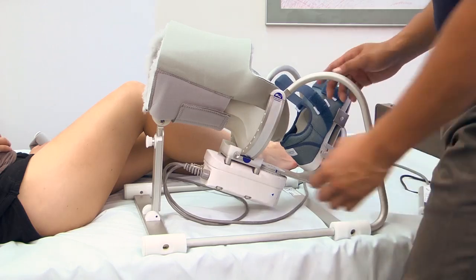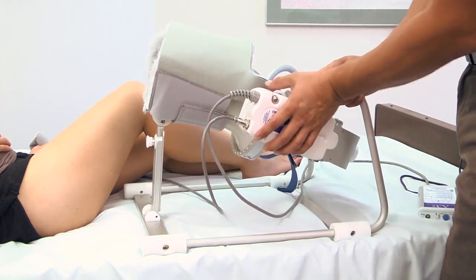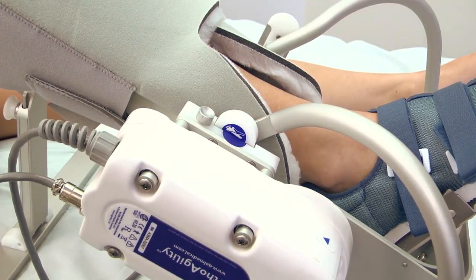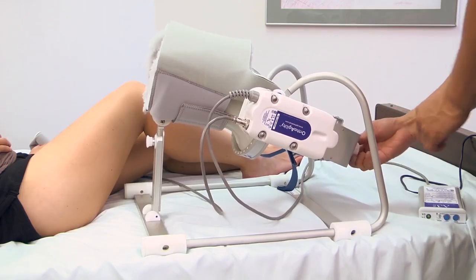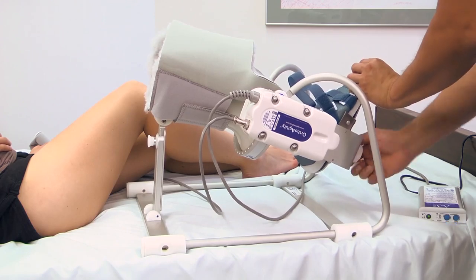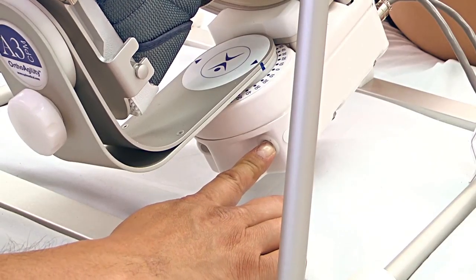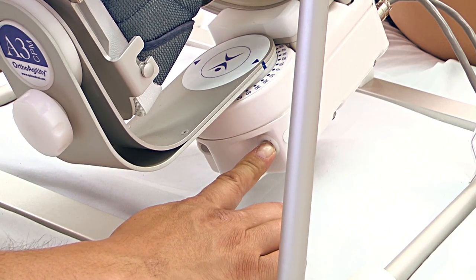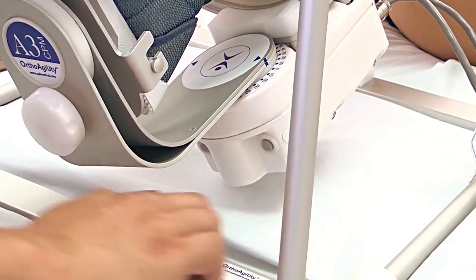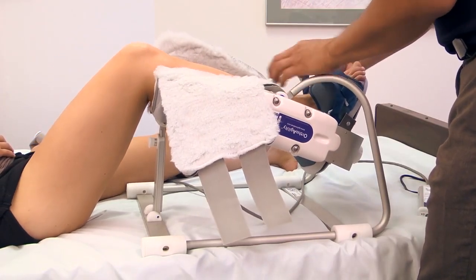For plantar dorsiflexion, press and hold the actuator button while rotating the actuator to the top of the actuator ring. The two halves of the blue indicator dot should meet. Next, loosen the footplate locking knob and swivel the footplate until the shoe is again in an upright position. Before placing the patient in the unit, run the actuator using the forward and reverse buttons until it reaches zero degrees on the goniometer. Now place the patient's foot in the shoe and tighten the straps.